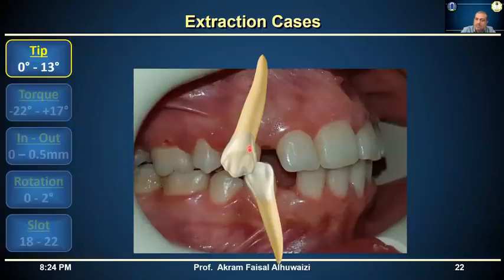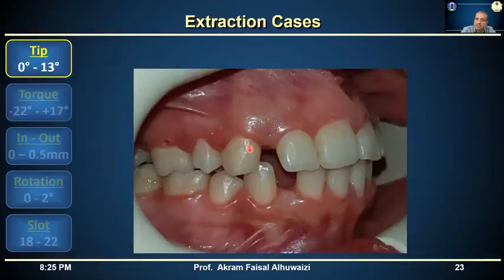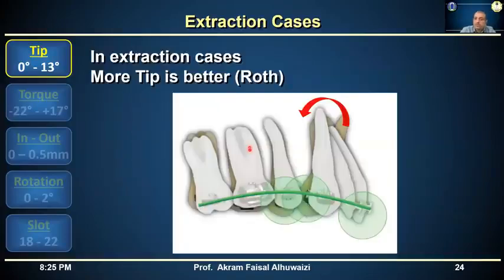And distal tipping of the canines isn't without cost, because this severe distal tip is going to cause the roller coaster effect. This roller coaster effect is, as this canine moves backwards, it's going to move the incisors downward, because this tip in the bracket is going to push the crowns down, push this wire down, and it's going to push it like this. And it's going to cause this arc because it's going to push the premolar up, incisors down, causing this roller coaster effect.